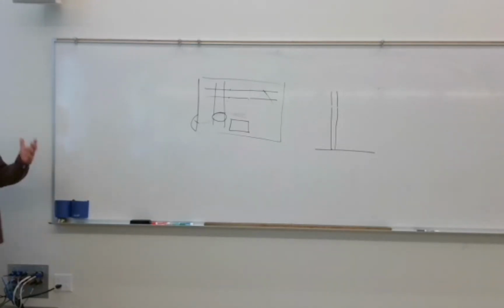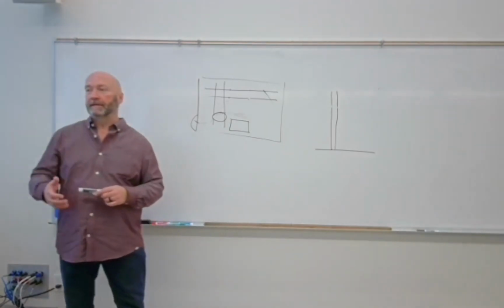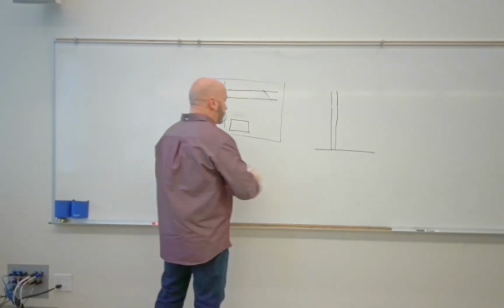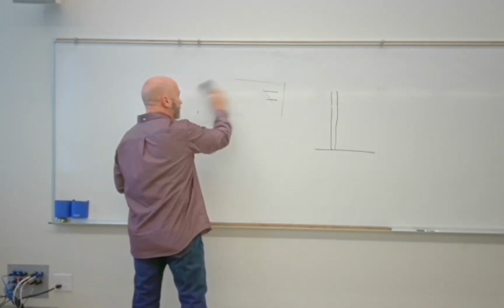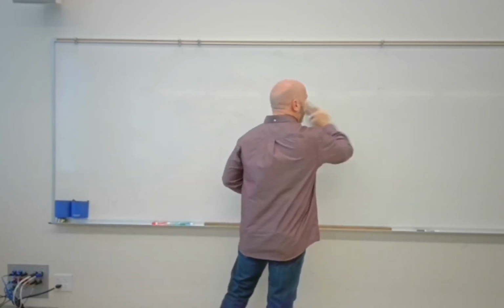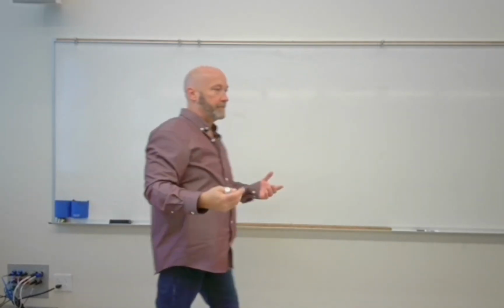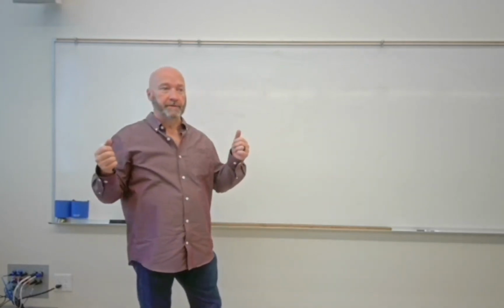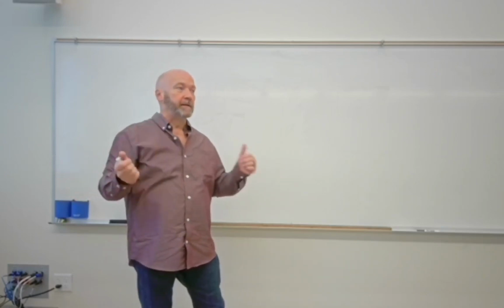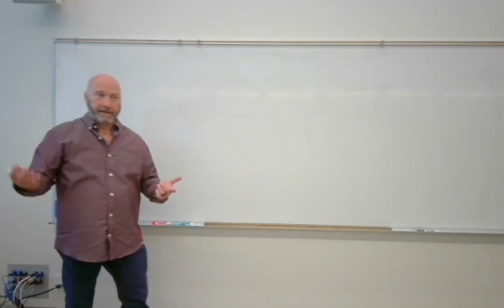And then the X-ray tube that you see, you don't really see the X-ray tube. You see what we refer to as protective housing. So protective housing does a lot of stuff. It holds the X-ray tube inside of it, and it protects you from stray X-rays as much as it can, but it also protects the X-ray tube against you as well. Sometimes you take your fingers off the buttons a little bit too quick and the X-ray tube comes to a sudden stop, right? And some of that rough handling sometimes can damage the X-ray tube. So the protective housing is supposed to help protect against that.